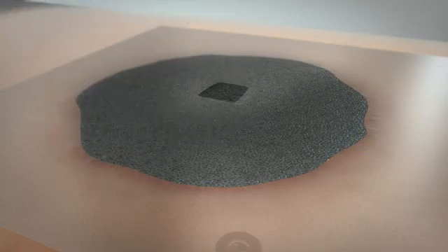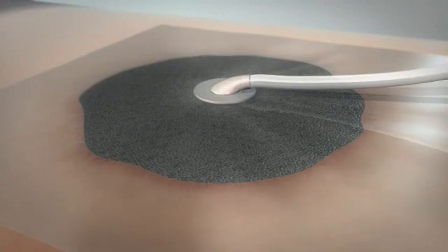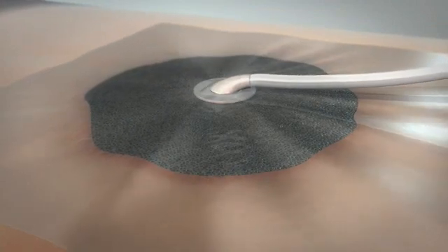In combination with sophisticated software, TRAC technology helps provide uniform negative pressure to the wound surface.